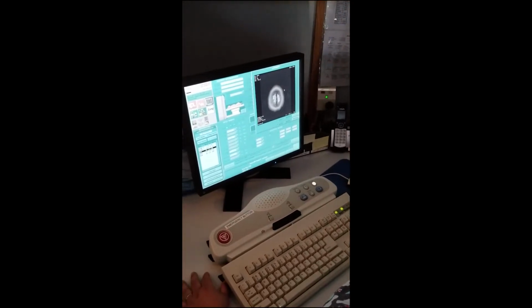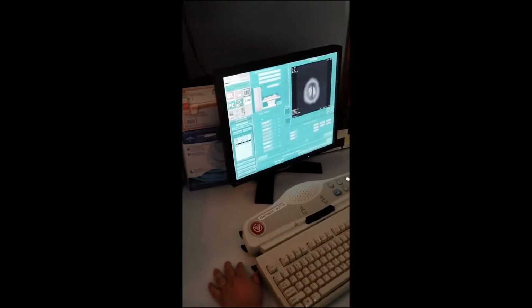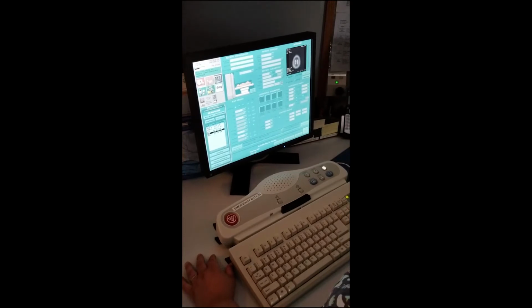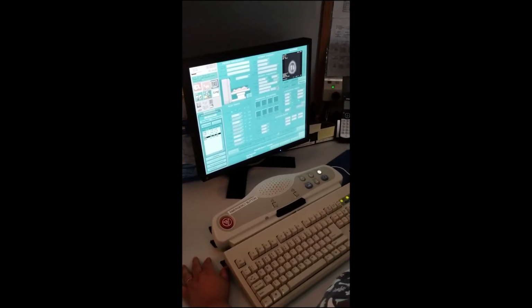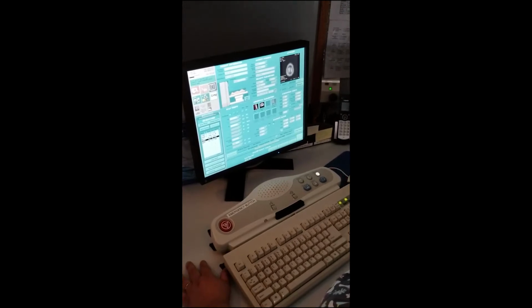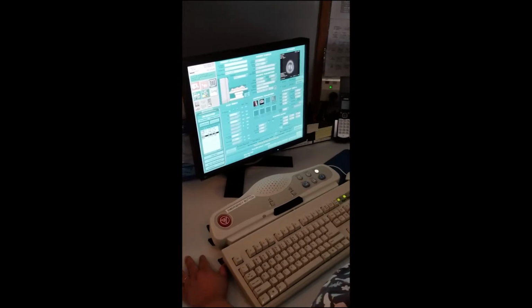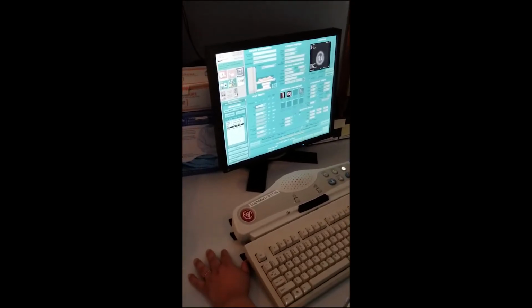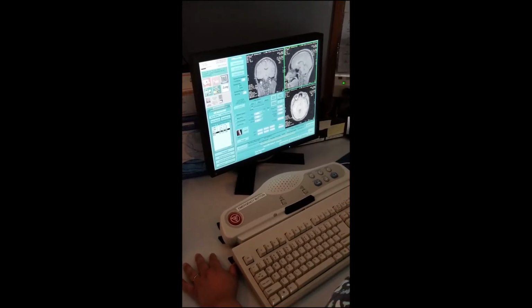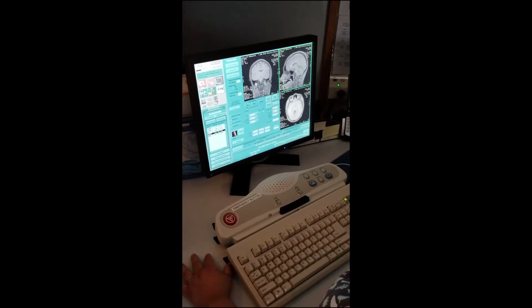Okay, go ahead. Do your coronal. Coronal PD. So we have done T1. T1 was short. T2 long. Now we're gonna do PD. Long, short? The TE is long and the TR is short. No: TR is long, TE is short. Sorry. That's okay.